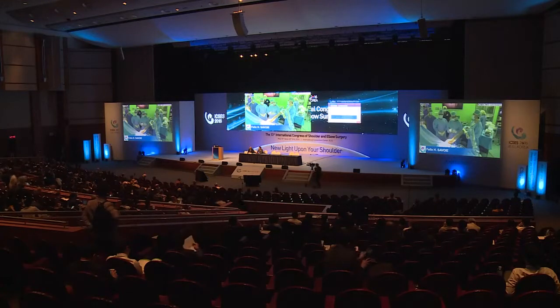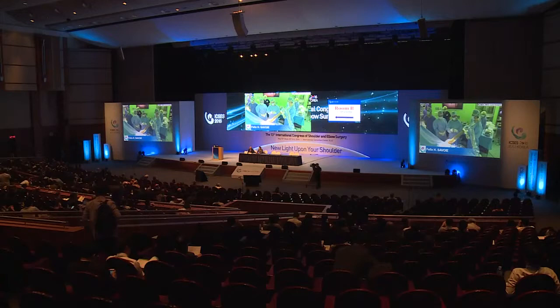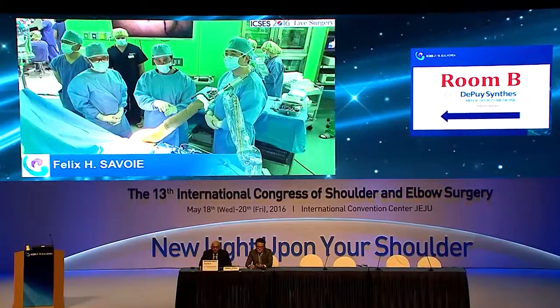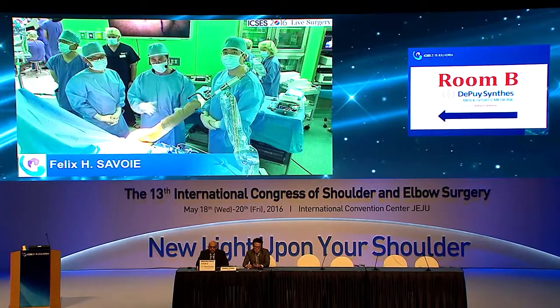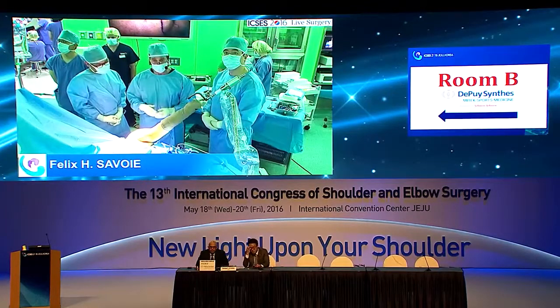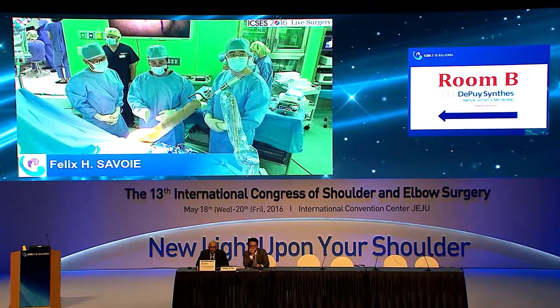Now that edge right there is supposed to be sitting right on the greater tuberosity at the articular margin. So my sutures go precisely at the point where the undersurface tear stops and the part of the tendon that's supposed to be placed right into the trough. So I would be very concerned with overtensioning. You could easily see we did not overtension it as we rotated it back and forth and abducted and adducted it. So I think, at least to me on rotator cuffs, my job is to get that part of the cuff right off to the articular surface and get that to heal.